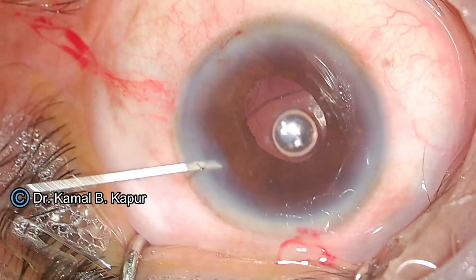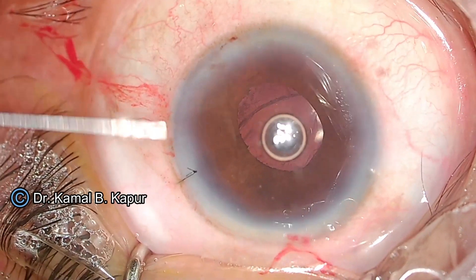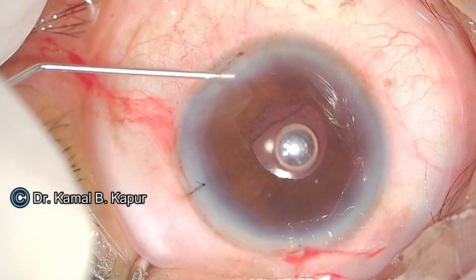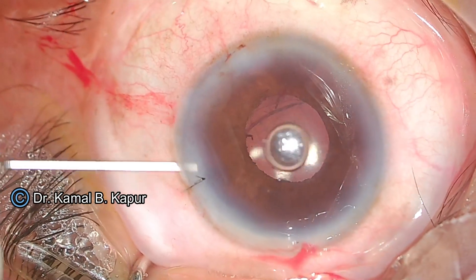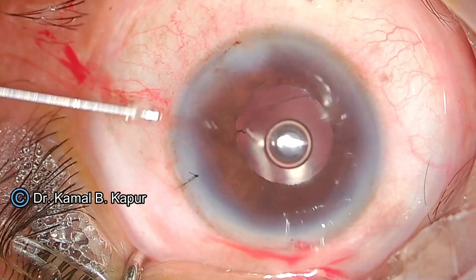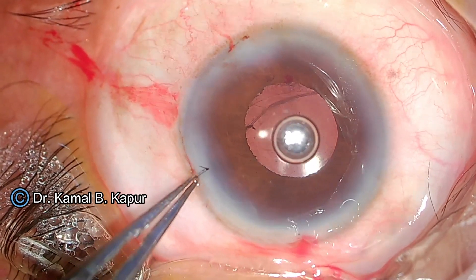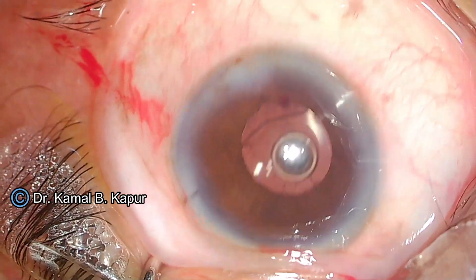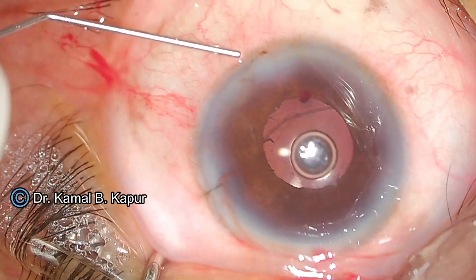I put a miotic in the eye, ensuring the pupil is closing well. There is no peaking and no vitreous in the anterior chamber. Once the surgery is over, we notice a perfectly round pupil. This patient was doing very well — on the first post-operative day, the patient had unaided vision of 6/12, and over time improved to 6/9 unaided. Skill, technique, and patience always pays off. Thank you.